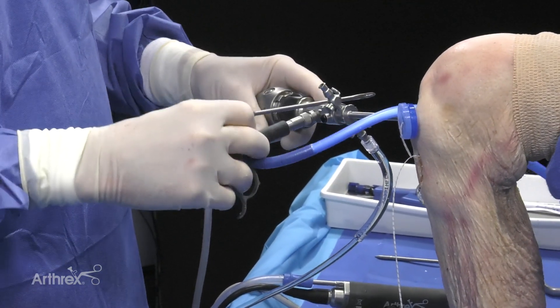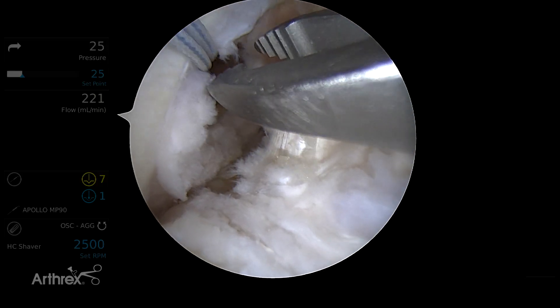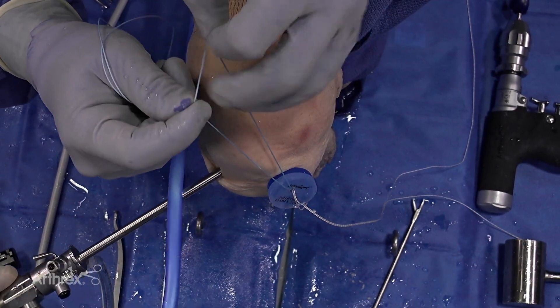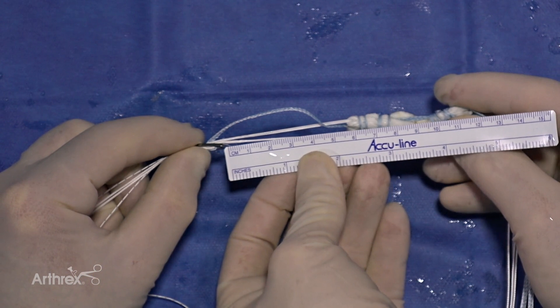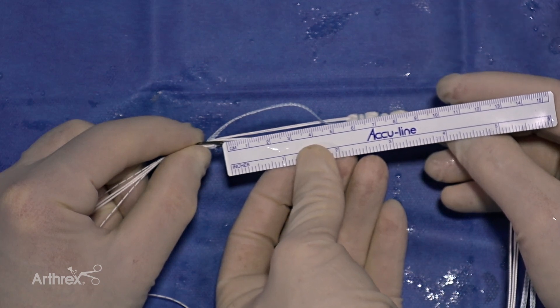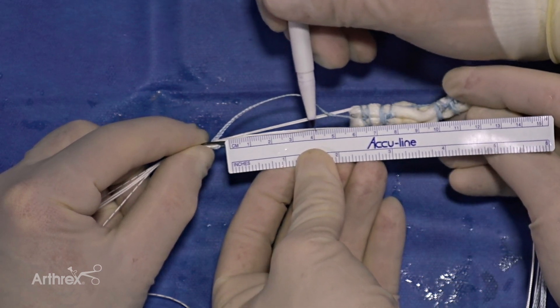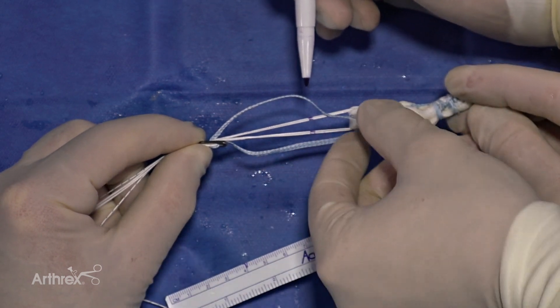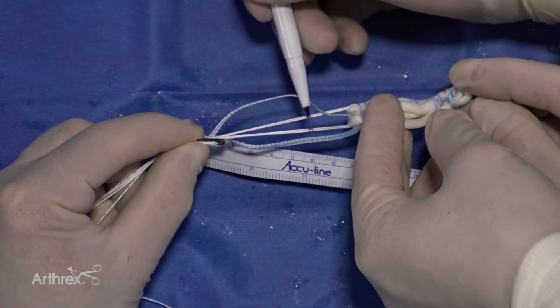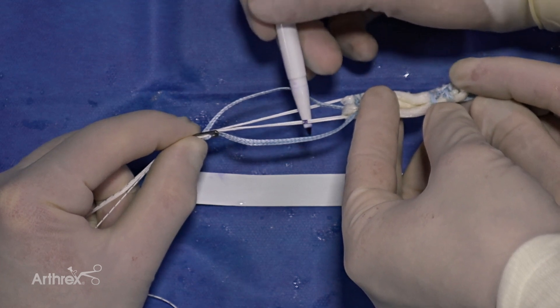Now we're going to pass our graft. We have to retrieve our docking suture from the femoral socket. Having the passport cannula in place makes this very easy. Here's our femoral docking suture out the passport cannula with our tibial suture. What I'm showing here is a nice trick to allow for easy passage of your button on the femoral side without using x-ray intraoperatively. Our intraoperative distance measured when we created the femoral socket was 40mm. We're marking our strands at 40 from the distal end of the button, because the button will go out the small femoral hole and flip on itself at 40 millimeters, which would be the aperture of the hole on the femoral side.